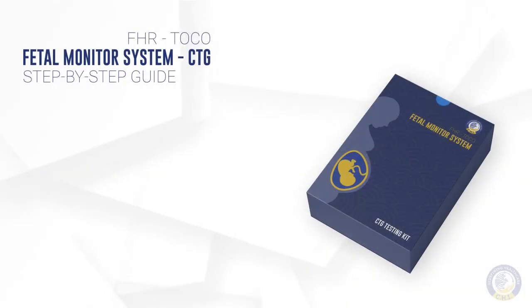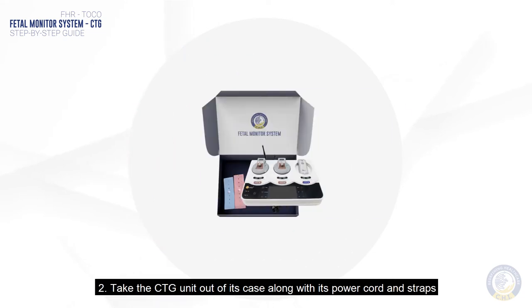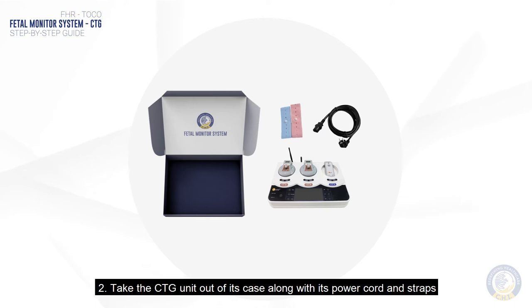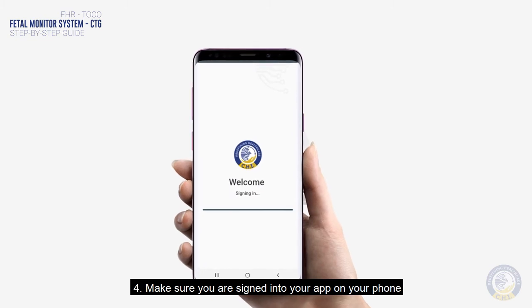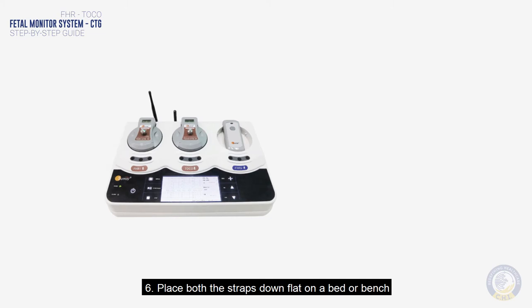A step-by-step guide of CHI's fetal monitoring system CTG. Wear loose, comfortable clothing. Take the CTG unit out of its case along with its power cord and straps. Plug the unit into the electrical wall socket. Make sure you are signed into your app on your phone, then turn on the unit via the power button.